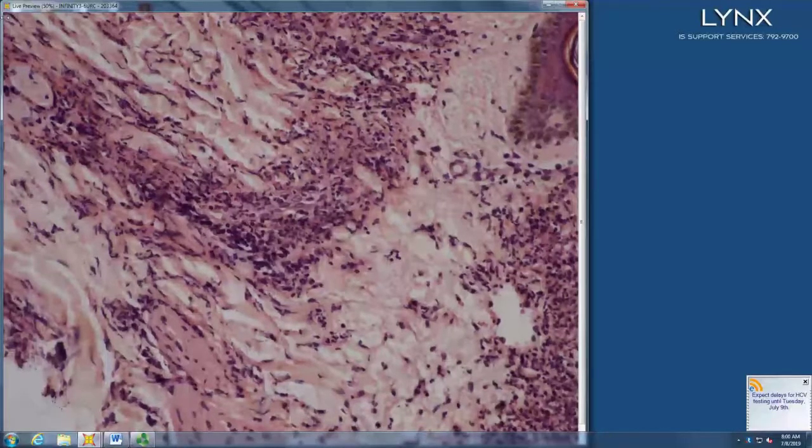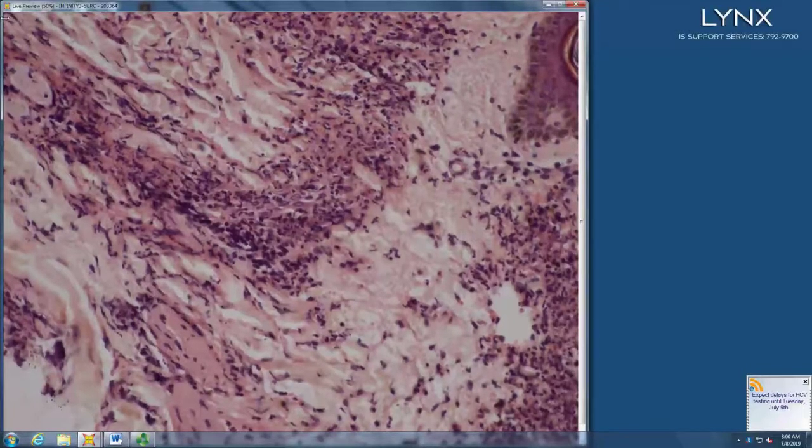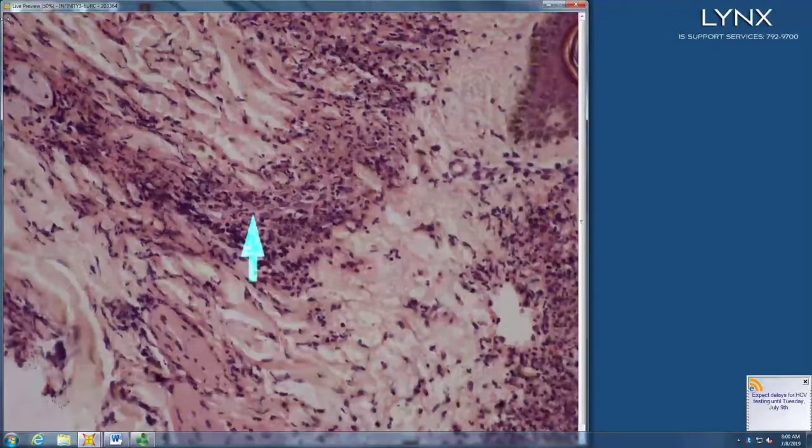Vasculitis. So LCV. And in this one, we can't see if it evolves deep, but we can see that your endothelium is completely intact. There's no endothelial necrosis. So name a group of disorders that would tend to do that. Cutaneous small vessel vasculitis.